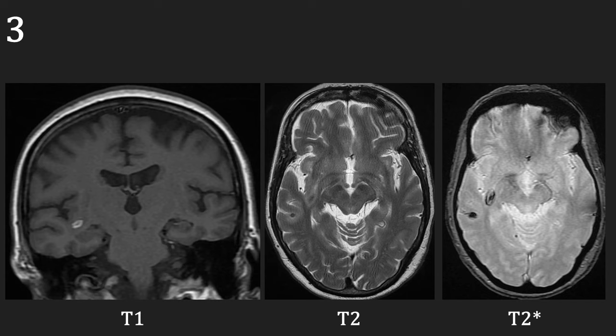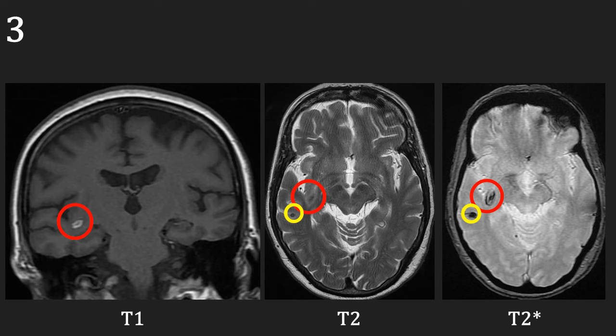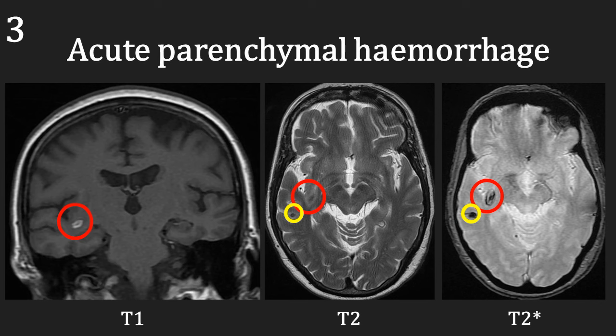This is a 75-year-old female patient who has been thrombolyzed for a stroke and was not improving, so an MRI was requested for further evaluation. On the coronal T1, we can see an area of high signal adjacent to the right sylvian fissure in the white matter. This is matched by an area of low signal on the axial T2 and also low signal on the T2 star. Furthermore, posterior lateral to this, in the right temporal lobe, there is another area of low signal abnormality on both the T2 and T2 star. This represents an acute parenchymal haemorrhage.